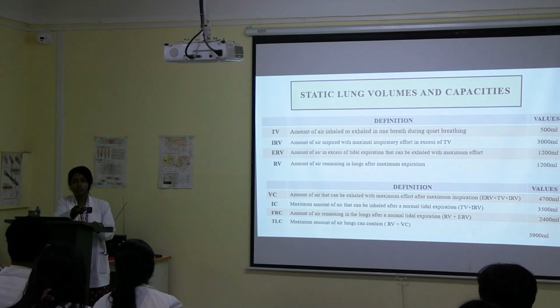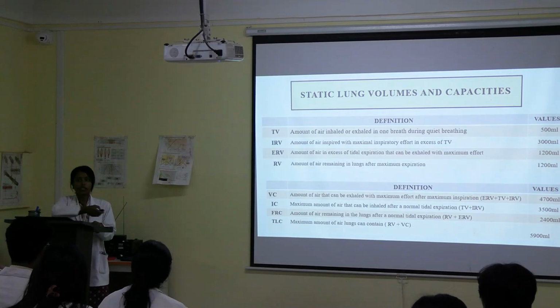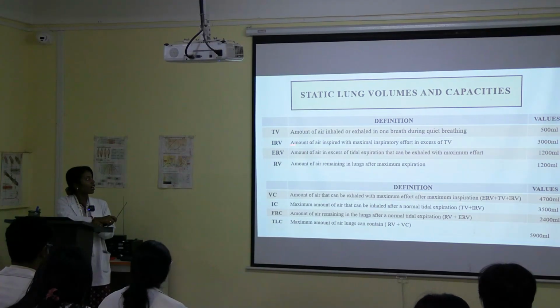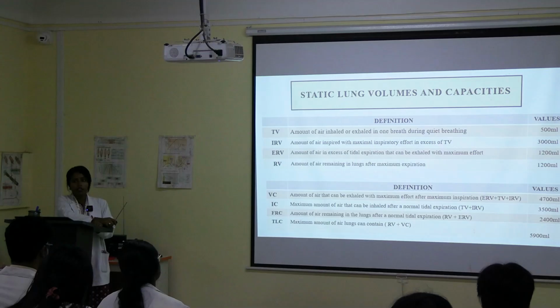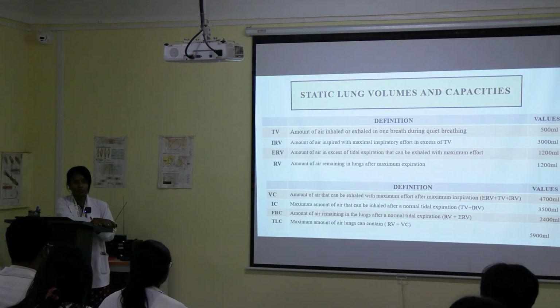So now you are sitting. So now you are in tidal volume, normally breathing in and out. That is your tidal volume. Then IRV is the inspired air with maximal inspiratory effort. Okay. Normally it is 3 liters.